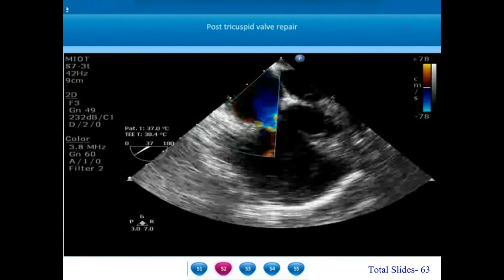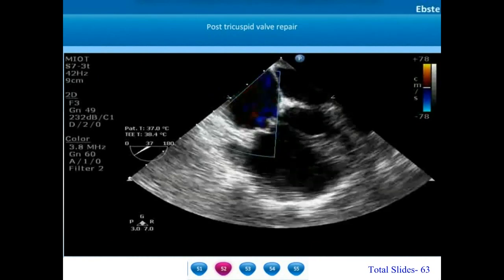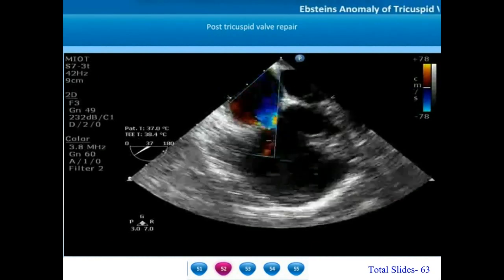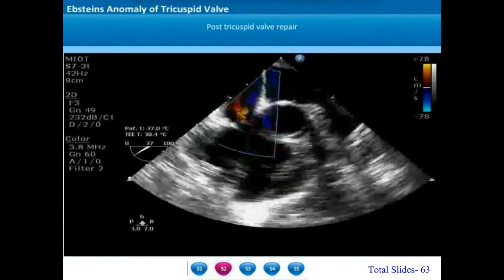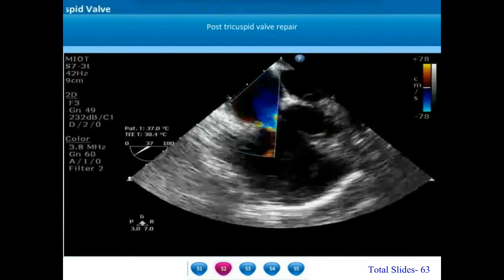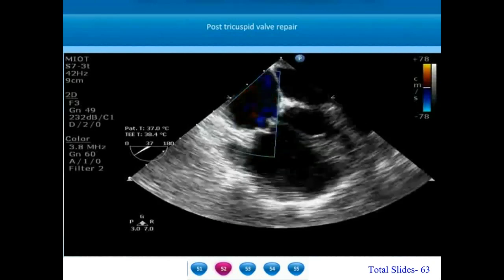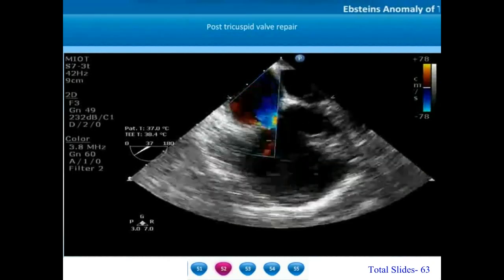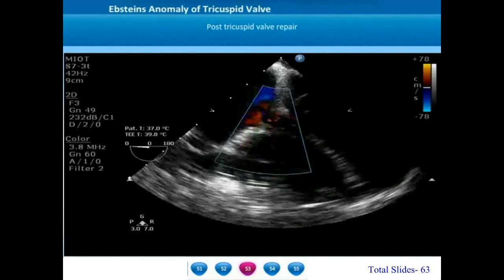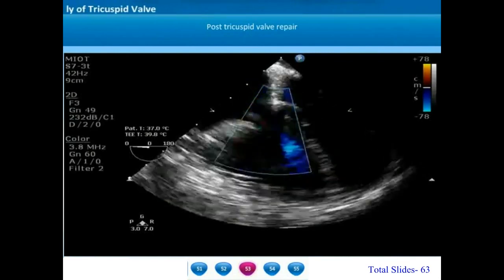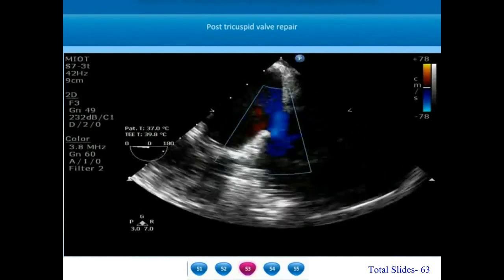Tricuspid valve repair is done by plicating the atrialized right ventricle so that the AV junction is brought back to its normal position. On this post-operative transesophageal echocardiogram, we can notice that the tricuspid annulus has been reduced with suture annuloplasty and by plicating the atrialized right ventricle, the annular plane has been brought superiorly to the normal level. There is mild tricuspid regurgitation of low velocity. Post tricuspid valve repair, we can notice the small tricuspid annulus reduced by suture annuloplasty and a mild tricuspid regurgitation jet.